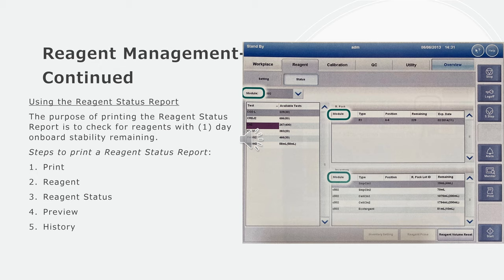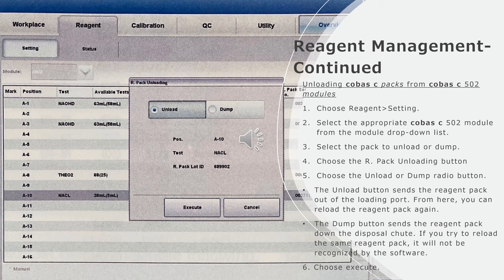Using the reagent status report: The purpose of printing the reagent status report is to check for reagents with one day onboard stability remaining. Steps to print a reagent status report: Go to print button, then choose reagent, reagent status, preview, and then history.